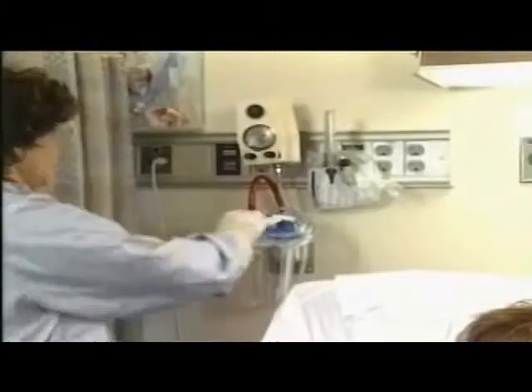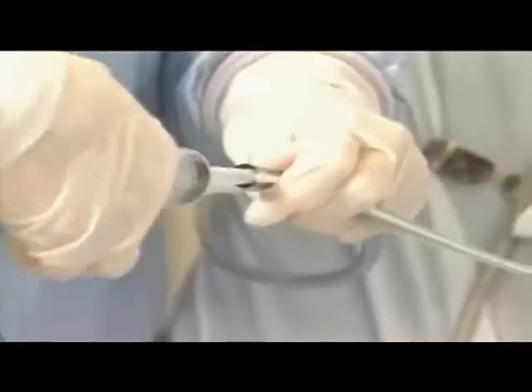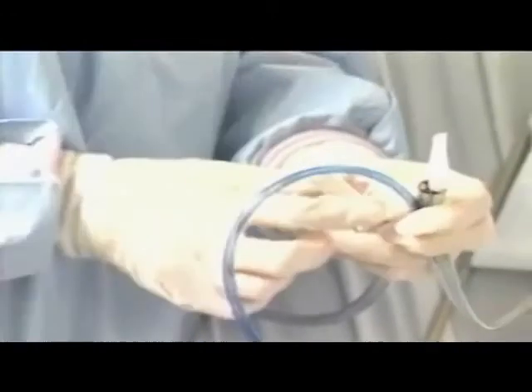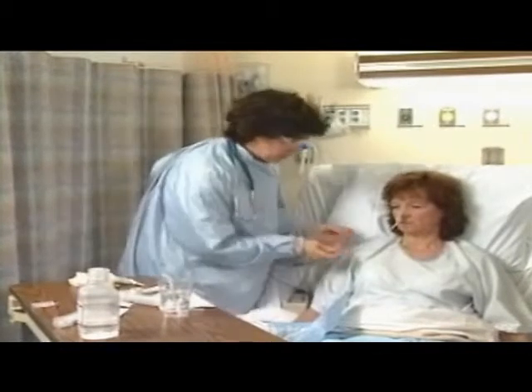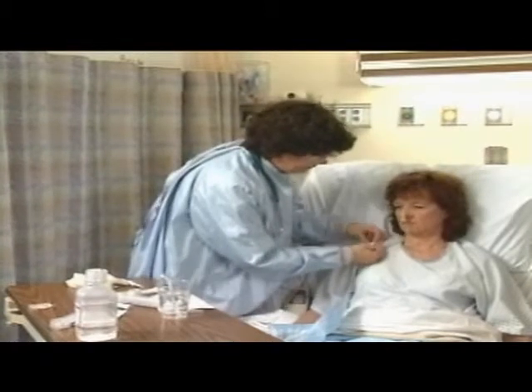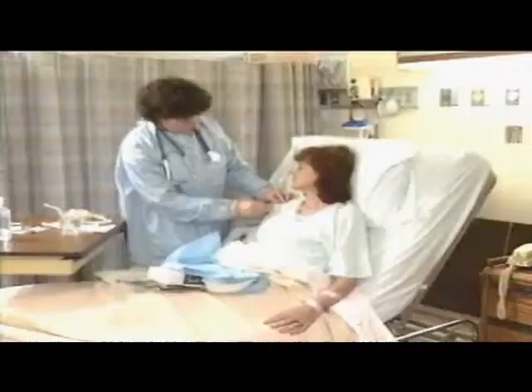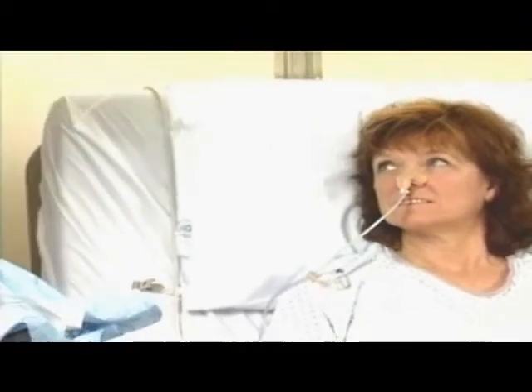Once tube placement is verified, clamp the end of the tube or connect it to appropriate suction. Secure the tube to the patient's gown by looping a rubber band around the tube and pinning it to the gown. Unless ordered otherwise, the head of the bed should remain elevated 30 degrees or greater. Your nose and throat should start to feel better as you get accustomed to the tube. When you need to ambulate, we can clamp the end and take it off suction for a few minutes.